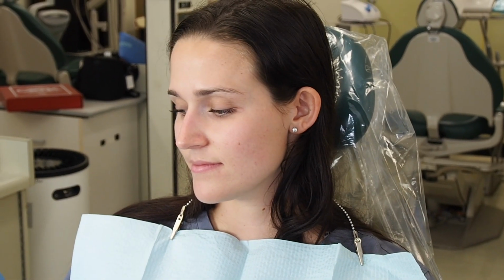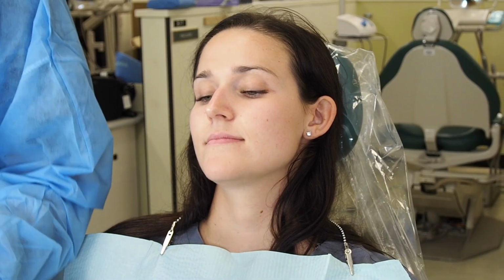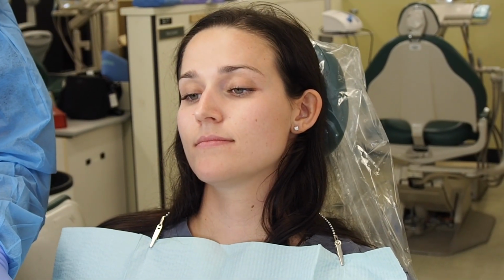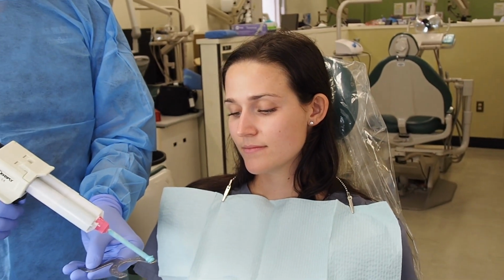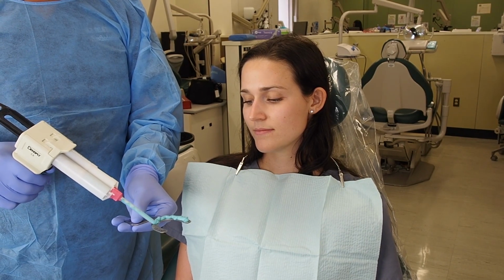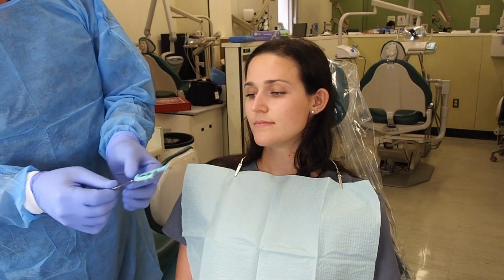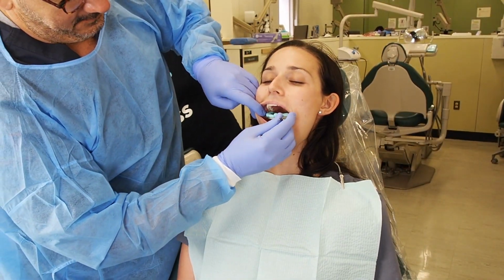The next step is to record the bite. In order for me to record the bite, I like to do it separately. Can you get me some cotton rolls, please? And what I'm gonna do is put some occlusion material, occlusion VPS or PVS occlusion material. I'm gonna set it here.